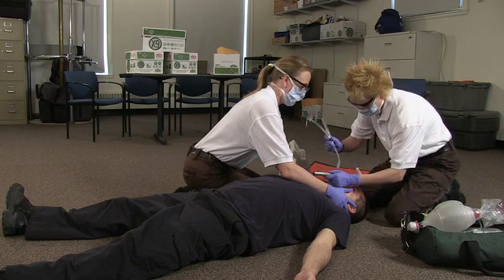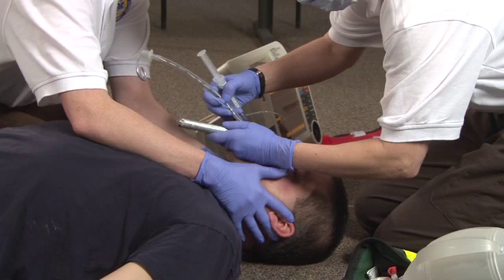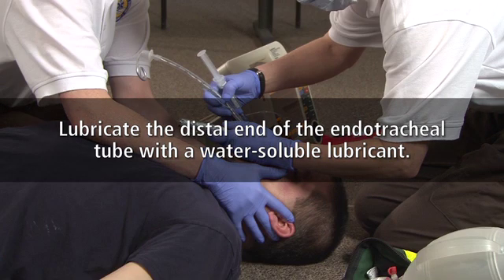If a malleable stylet will be used to shape the endotracheal tube for ease of insertion, it is placed inside the endotracheal tube with the end of the stylet about 1/2 to 1 inch from the distal end of the endotracheal tube. Next, the distal end of the endotracheal tube is lubricated with a water-soluble lubricant.